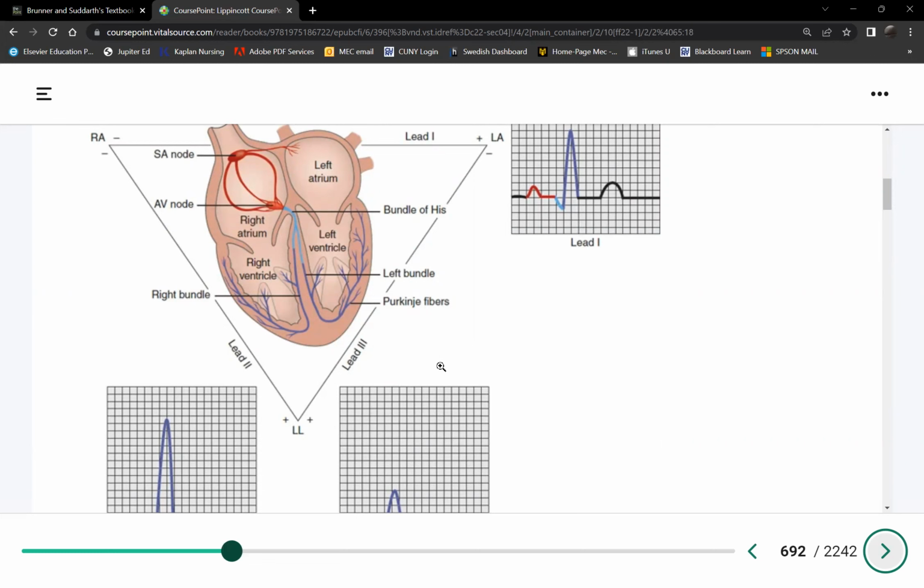Yes. The reason why you don't see a right leg here is the right leg lead really doesn't carry anything. So it's neither negative or positive. It's only a ground lead. Now you understand why there is a ground, meaning every electrical outlet you see there is a ground lead there. Okay, there's a positive and a negative wire, correct? And then why is there a green wire? What's the purpose of a green wire? The ground lead.